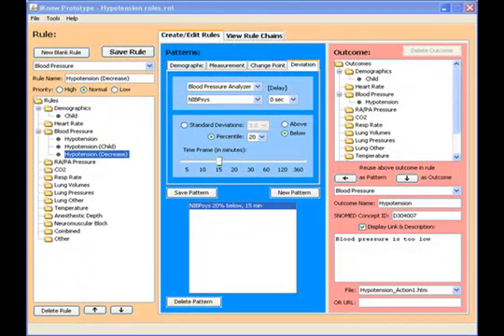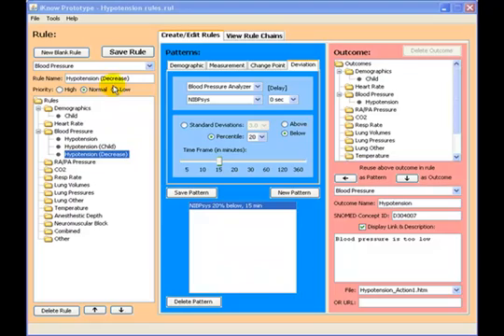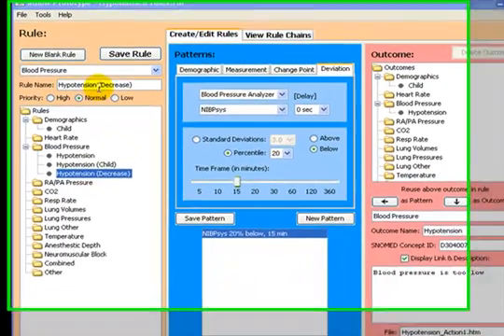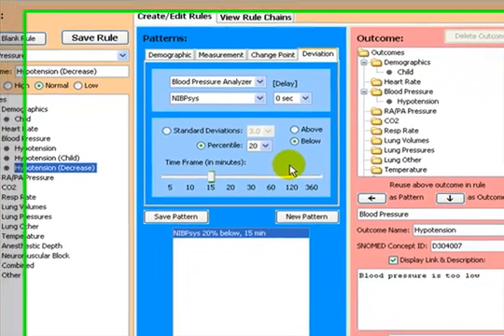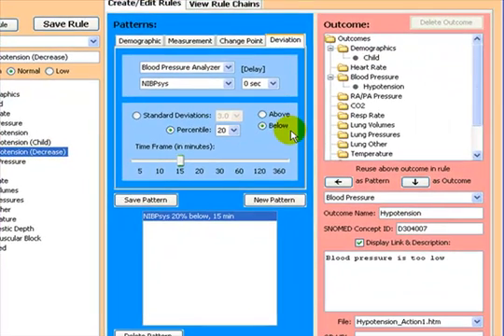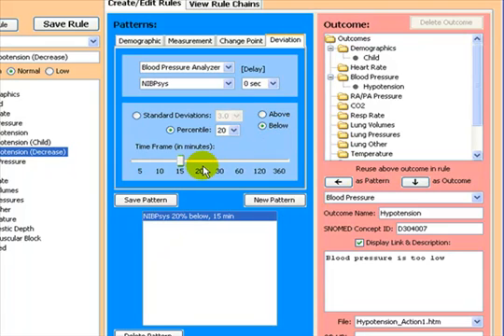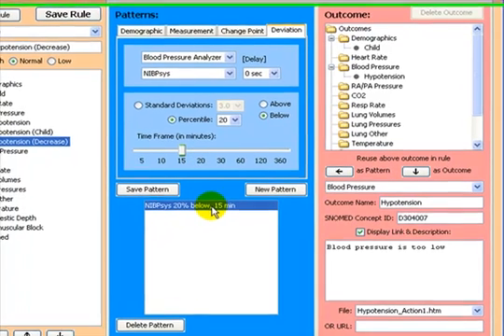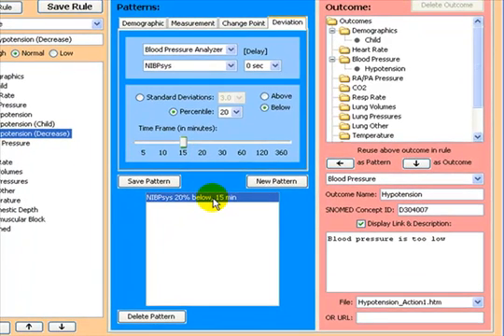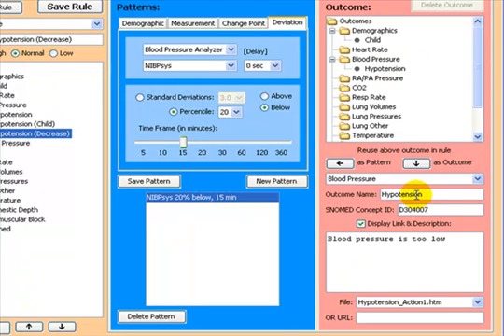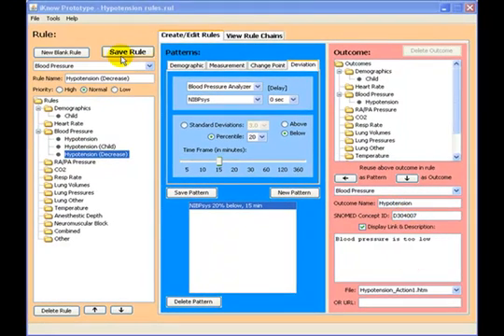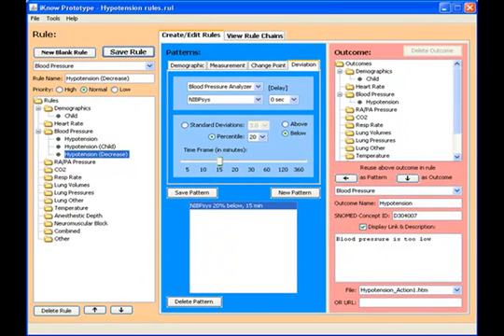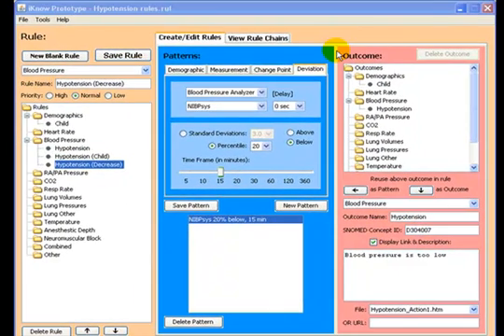We can also create a new rule to demonstrate how the deviation pattern works. For this we create a rule name called hypotension due to decrease in blood pressure. In the deviation pattern tab, we define a 20% decrease in the last 15 minutes in the systolic blood pressure as the pattern that would need to be matched to produce the same outcome hypotension. And once again we save this rule.